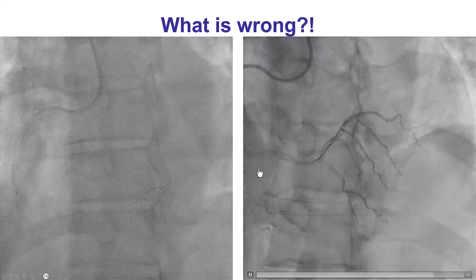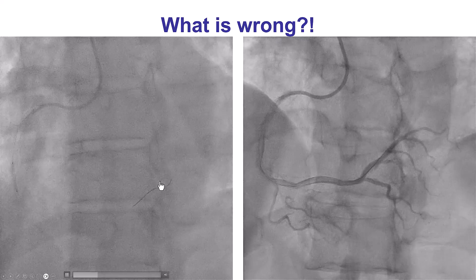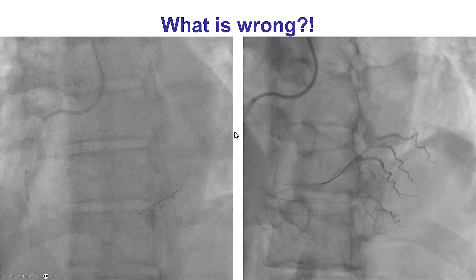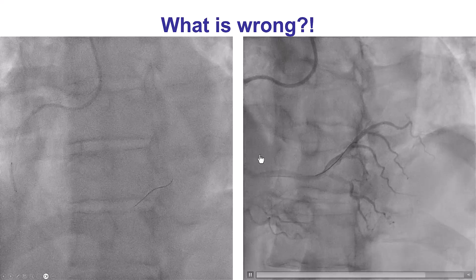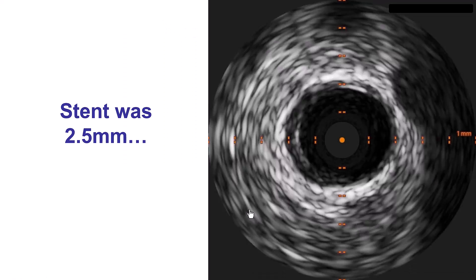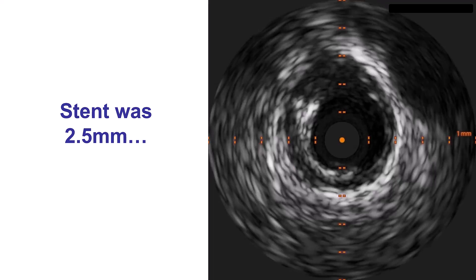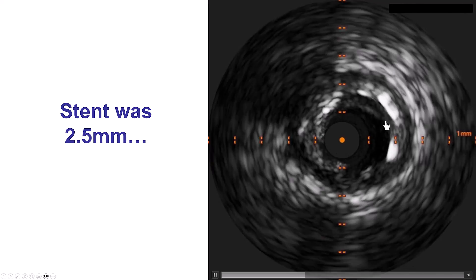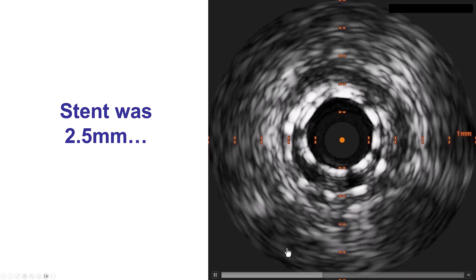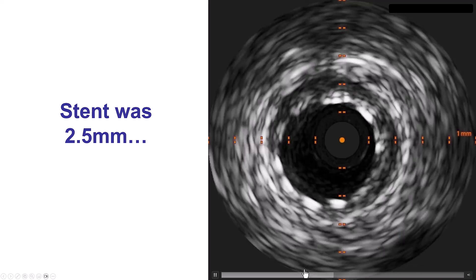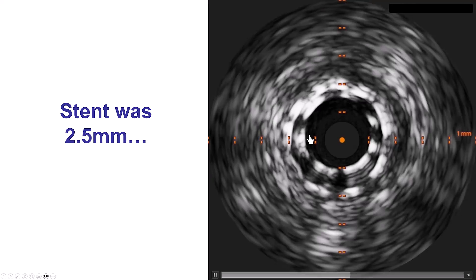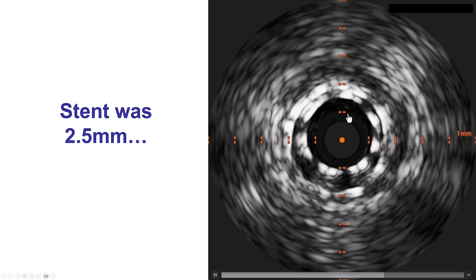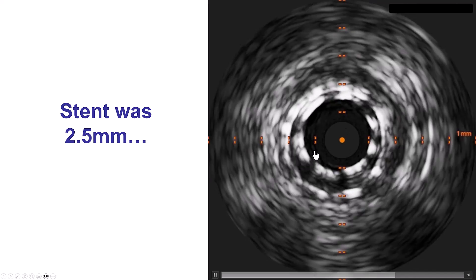Unfortunately, the result didn't look great. Although the stent seemed to be expanding, the vessel didn't look quite as good as the more proximal segment — which was surprising, because there was not much calcium as seen on the coronary CTA. So we decided to perform an intravascular ultrasound. On IVUS, we saw diffuse disease distally, and going into the area of the stent, the stent was streaming inside the other stent — indicating a much smaller stent than the originally placed stent. This was strange because we had asked for a 3.5×12 mm stent.